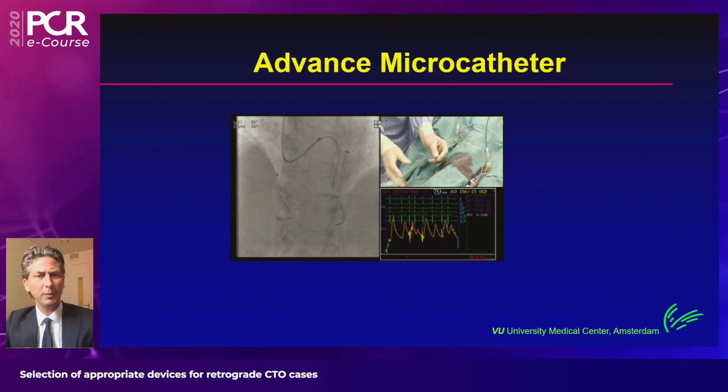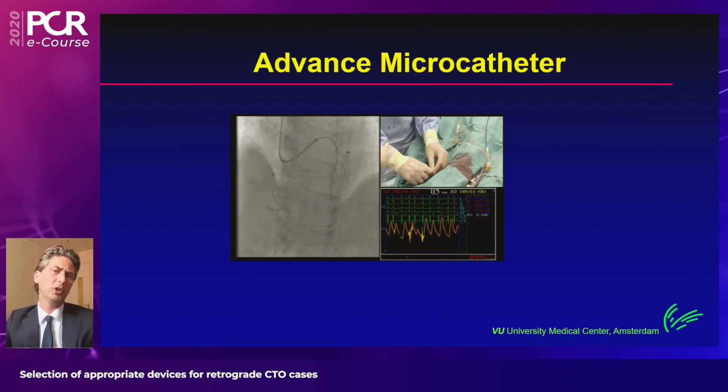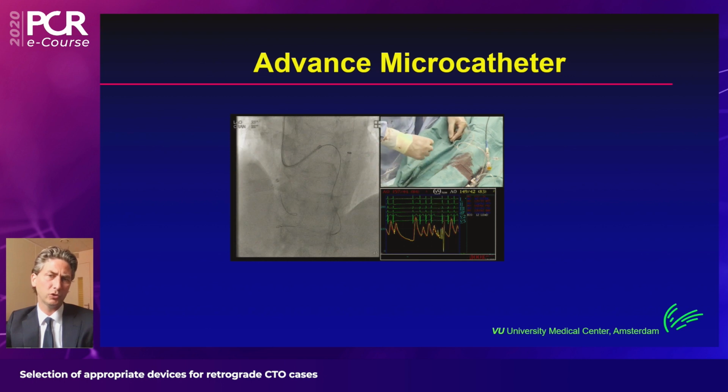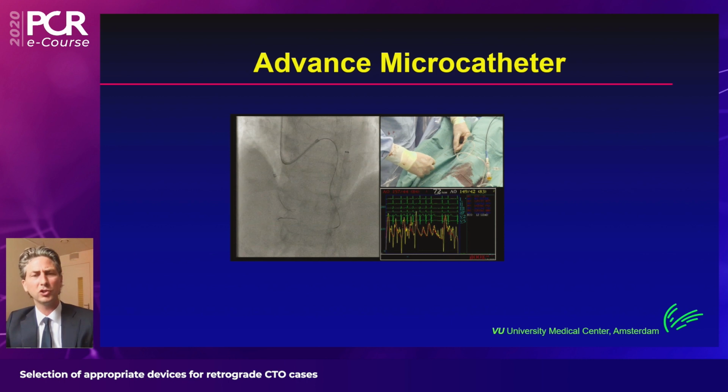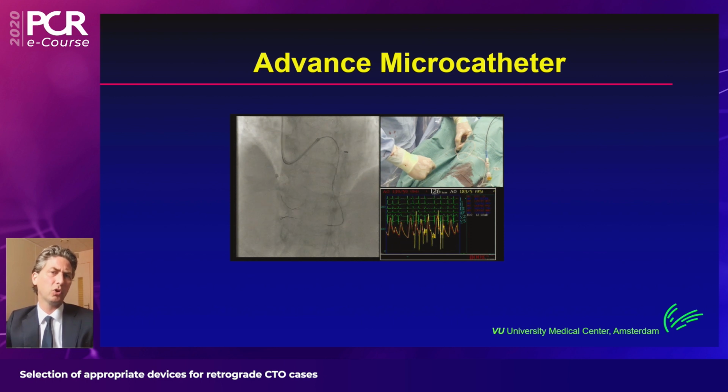Retract the wire just a little bit so the wire is free, and usually it will go once you build up tension and torque within a few rotations or so. As you can see right now, it's sort of stuck here. You don't necessarily need to balloon the track, just give it a little bit of time, and once it passes that junction, often it will go more swiftly.